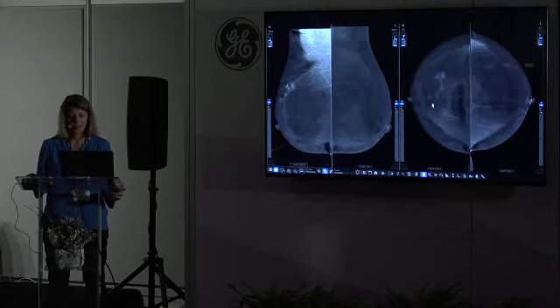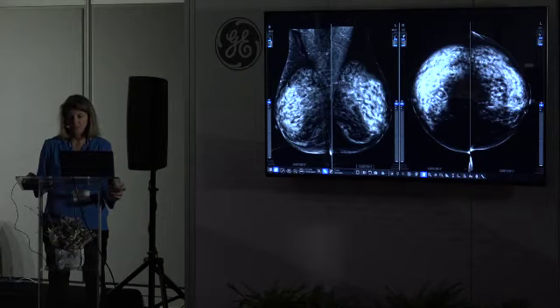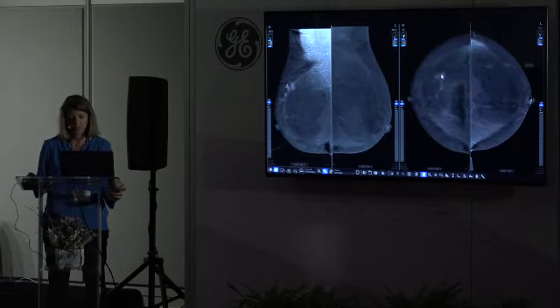And finally, we have a multifocal breast lesion here. So if I come back to this, maybe this distortion, yes, was here. And we have four different lesions. You see in this case a slight breast-in-breast artifact on CC, but absolutely not really on MLO.